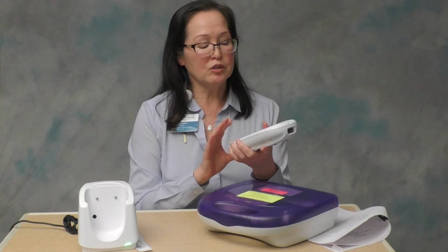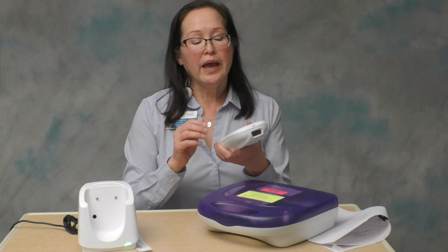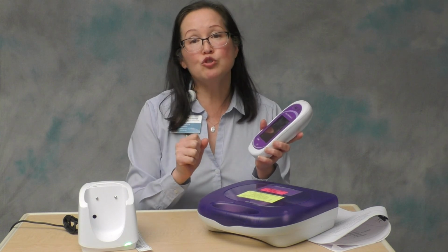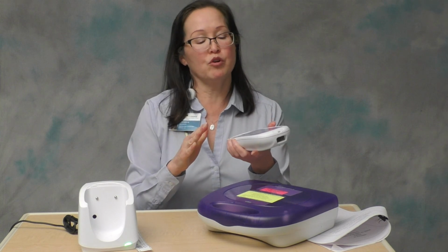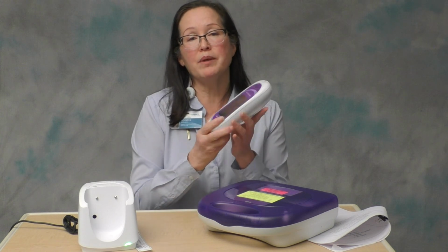So to clean them, you're just going to turn the meter off by hitting that on-off button. You're going to get one of your wipes, and if it's the last few wipes in the tub, they get a little juicy, so wring them out a little bit before you clean them. You're going to clean all surfaces, front, back, sides, top, and bottom.